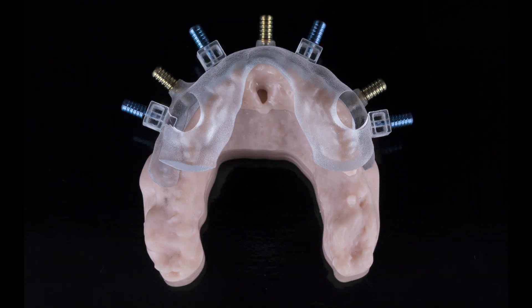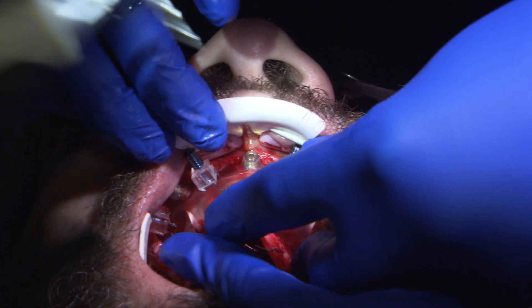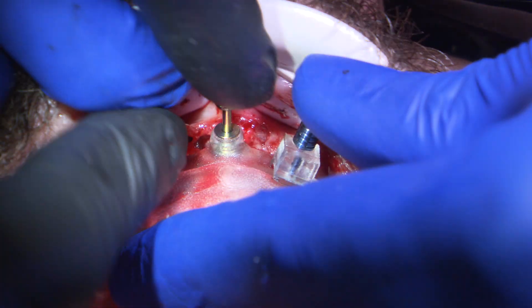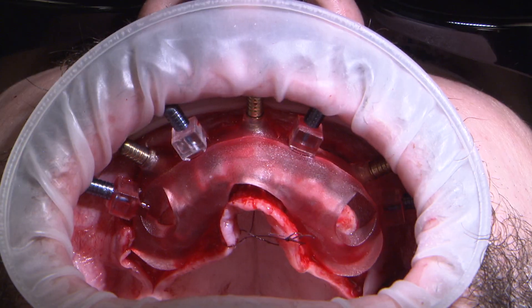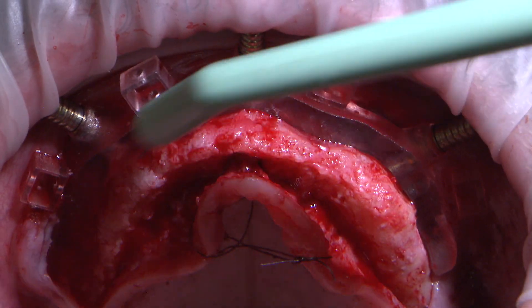The foundation guide and the mounting guide were connected with the blue interlocking pins prior to being positioned intraorally. The foundation guide seats only on the buccal surface. To ensure the guide is seated in the correct position, we utilize the mounting guide to verify the fit by ensuring it is flush with the bone. Once in a stable position, the anchor pin osteotomies were drilled and yellow anchor pins were placed to secure the foundation guide. We then remove the blue interlocking pins and the mounting guide is removed, leaving the foundation guide securely in place.